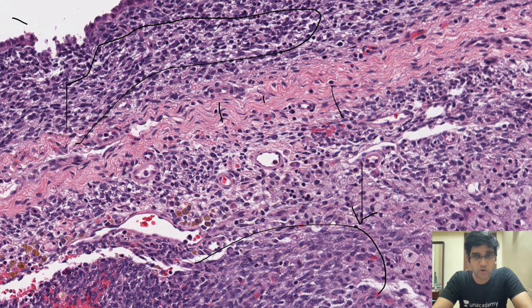So I'm seeing small round blue lesions in the pleural space, right? So I have many differential diagnoses in my mind. It could be a lymphoma, it could be a pleuropulmonary blastoma, it could be an embryonal rhabdomyosarcoma, right? There are lots of small cell tumors which can happen, right? So we did do the workup here. Unfortunately I don't have the IHC here, and it turned out to be a pleuropulmonary blastoma.